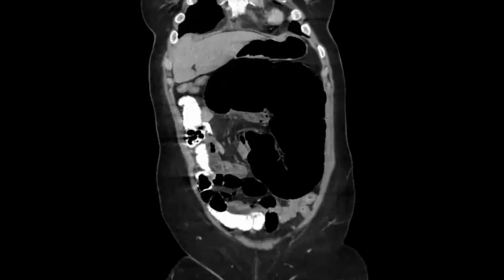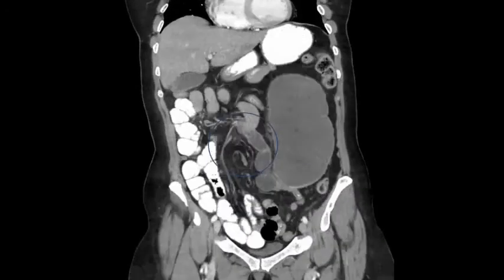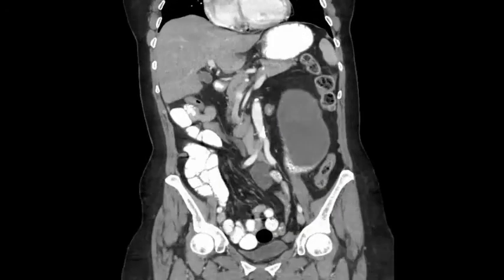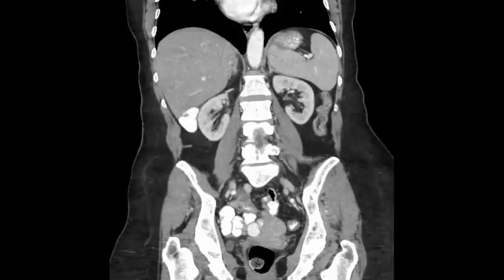Here's the coronal series. A major differential consideration here is a cecal bascule, where the cecum is folded on itself but there's no actual mesenteric twisting.